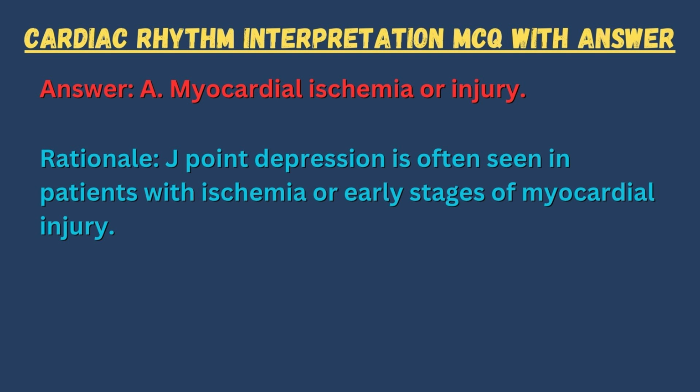Answer. A. Myocardial ischemia or injury. Rationale. J-point depression is often seen in patients with ischemia or early stages of myocardial injury.